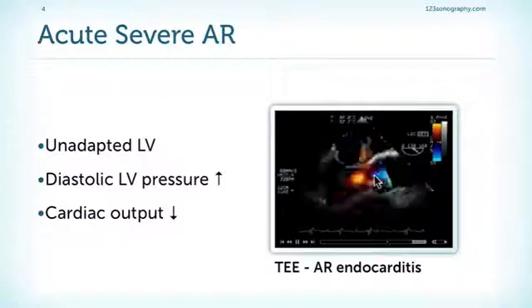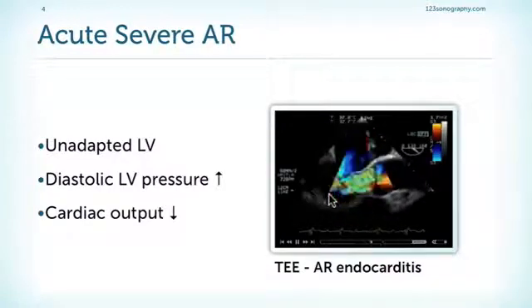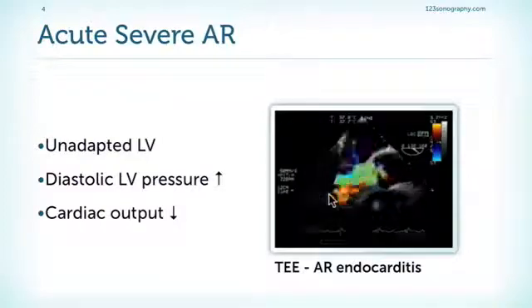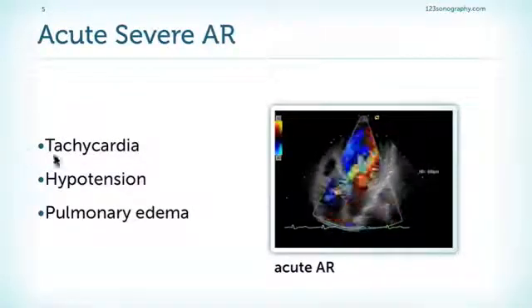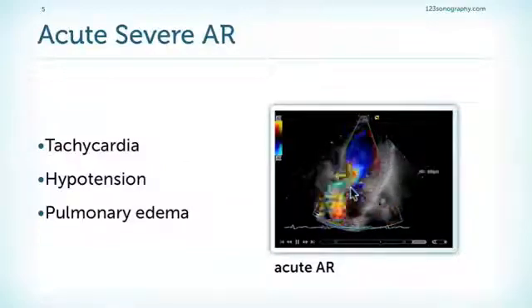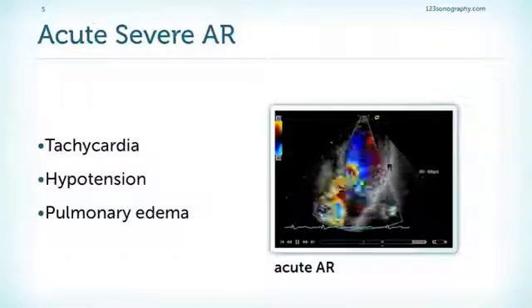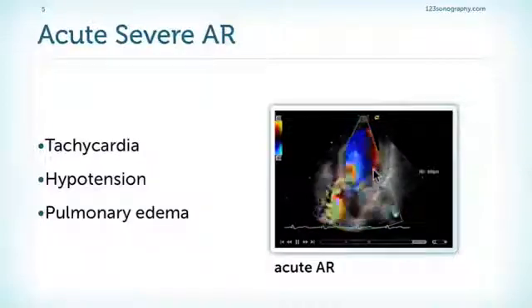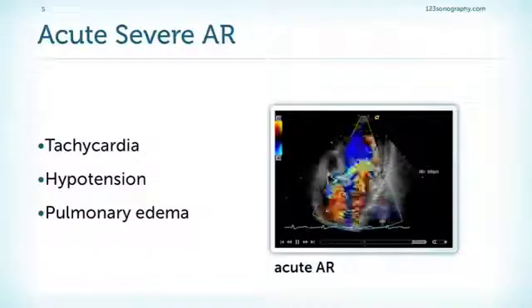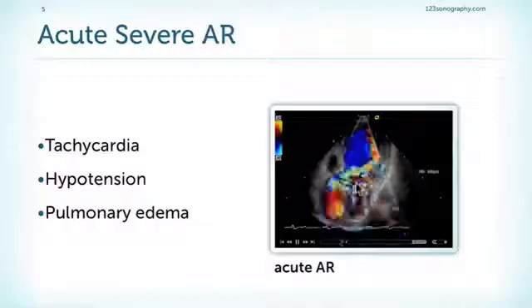We can see a very broad jet, and we also see that the patient has a fairly small ventricle. These patients usually also have a high heart rate — tachycardia — simply because they have to sustain cardiac output. And this makes it sometimes difficult to quantify aortic regurgitation. They have hypotension simply because they are in cardiogenic shock.